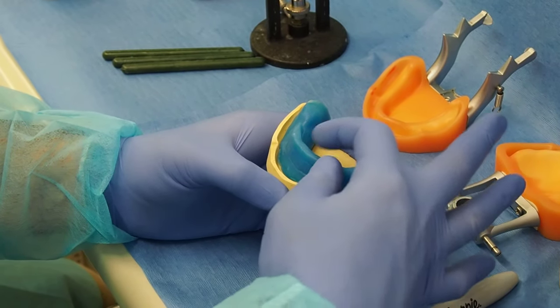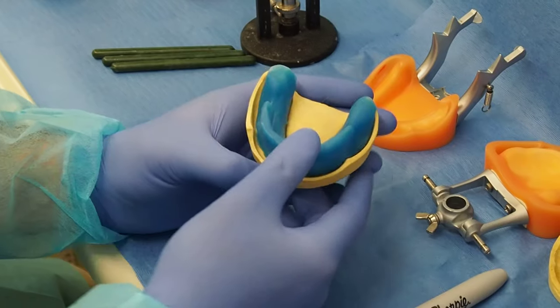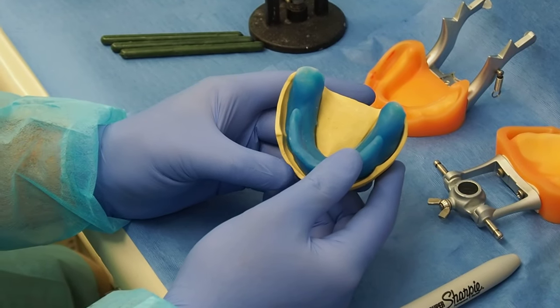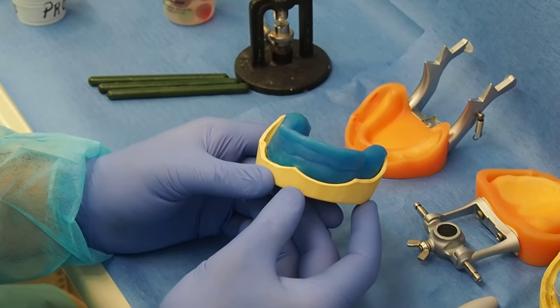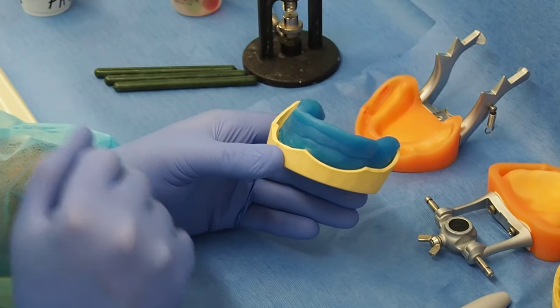Now if you see this one, it'd be about the size of an occlusal rim that you're going to make in a few sessions. Remember that word, occlusal rim.